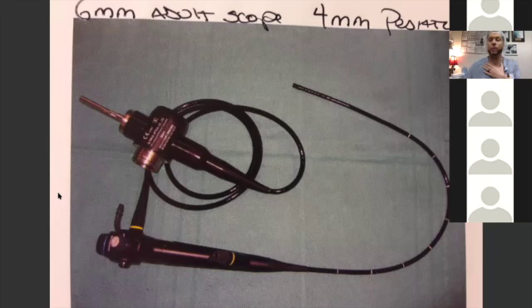And it is what I personally use for all my awake fiber optics because it's like driving a car. With the pediatric scope, you go in, it's a little flimsy, it gets dirty, you have to keep cleaning the lens. The adult scope is such a better experience and it makes this very simple. Now, when I was a resident, I complicated awake fiber optics. I said, oh, I hope I can get it in. It's so complicated, topicalization. Now I keep it simple.